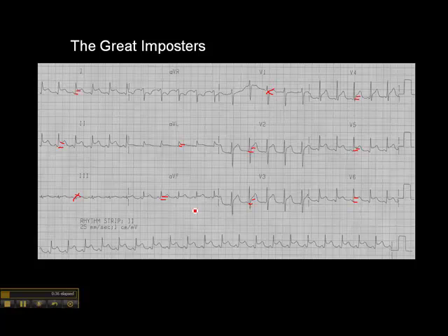Here's why it's so important to understand the ECG in relation to the coronary vessels. Remember, the inferior leads — the inferior wall of the left ventricle leads two, three, and AVF — are fed by the RCA in most of the population. So ST elevation in those leads would suggest an occlusion of the RCA.